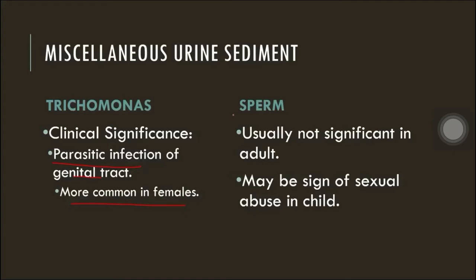Next, we have for sperm, usually not significant in adult. Okay, huwag nyo na pagpiestahan yung mga specimen na may sperm. Okay po. But take note that it may be a sign of sexual abuse in child. So, kapag nakita sa batang patient.